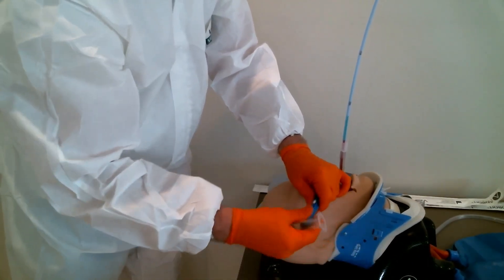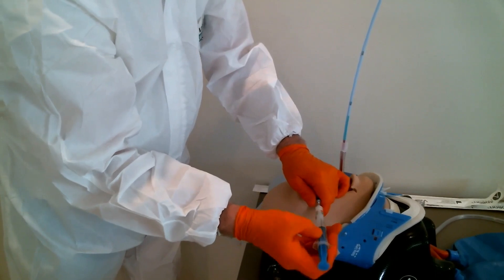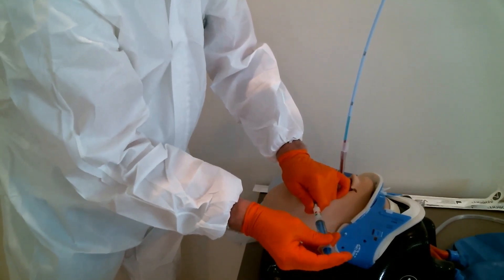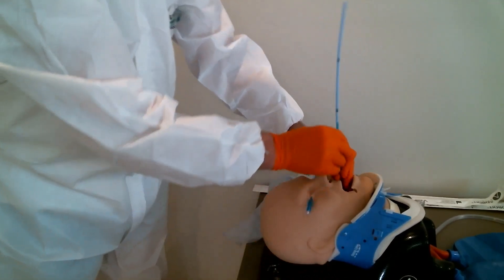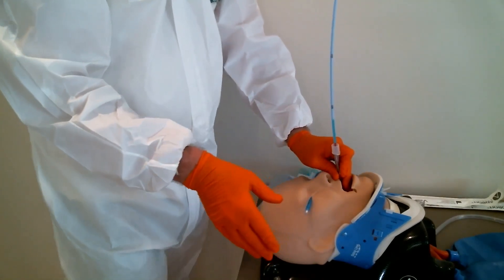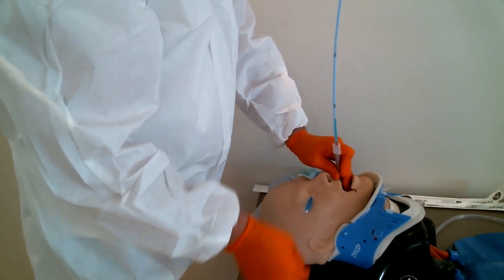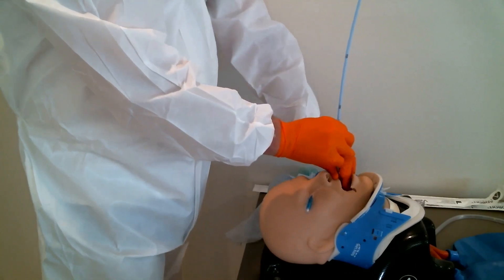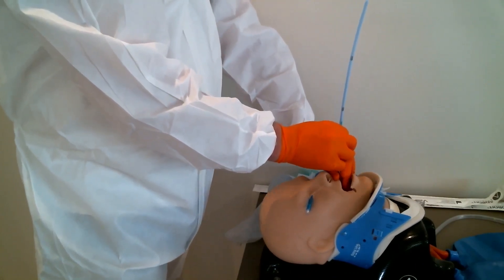And this is a little bit more challenging with PPE. I appreciate people challenging me to do it, intubate with PPE. All this PPE has been from our training closet. None of it has been wasted for this training video. It's all old or used PPE from our training closet.